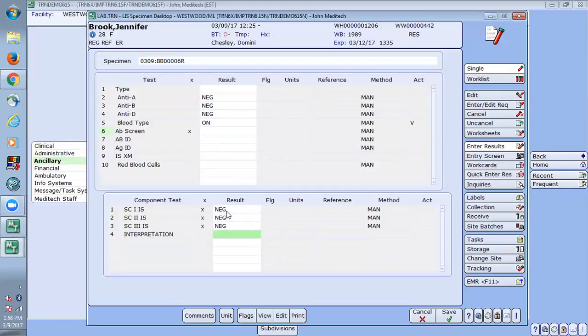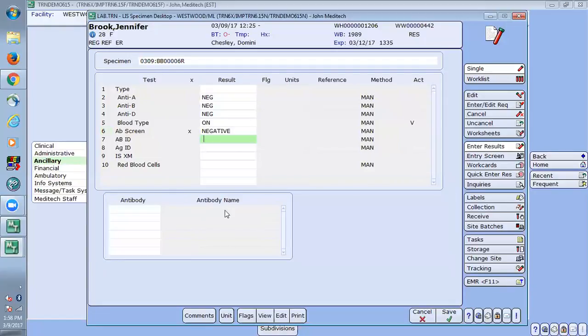If required tests are associated to this test, on page 6 of the blood bank test dictionary, we will not be able to result the overall interpretation until the required tests have results defined. Once resulted, the overall interpretation will file up to the AB screen prompt under the type, which I'll show now. So we see that overall interpretation has filed up to our AB screen prompt.